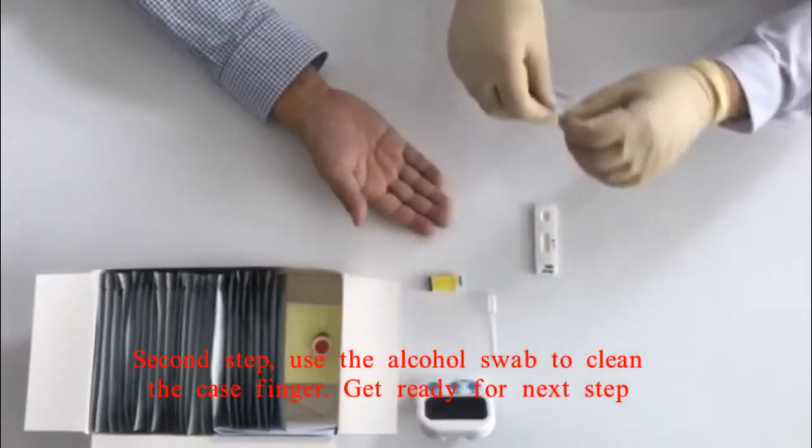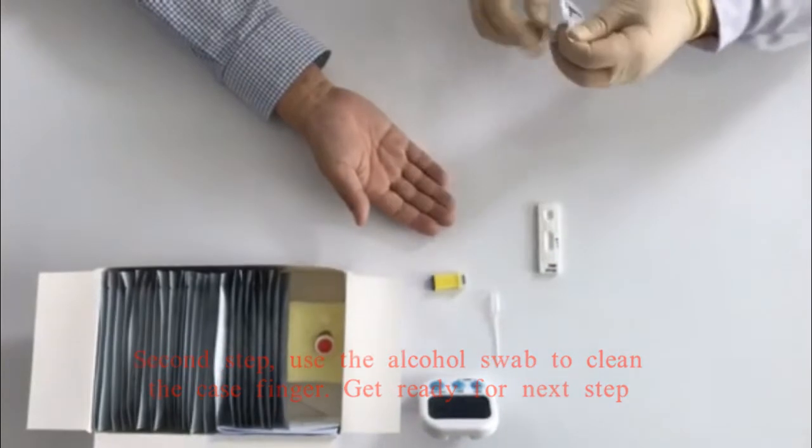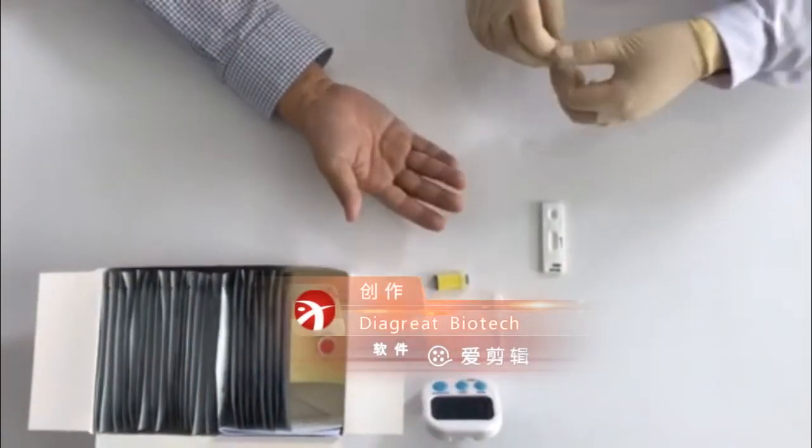Second step, use the alcohol swab to clean the case finger. Get ready for next step.